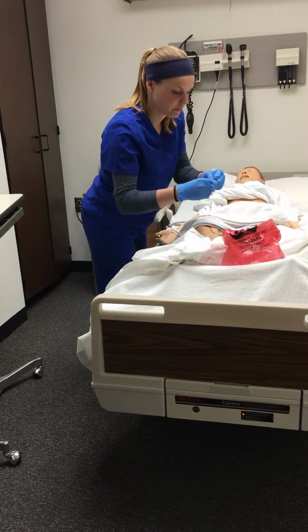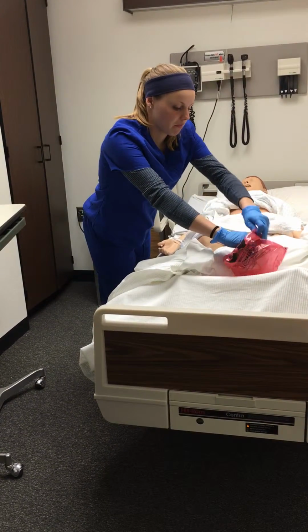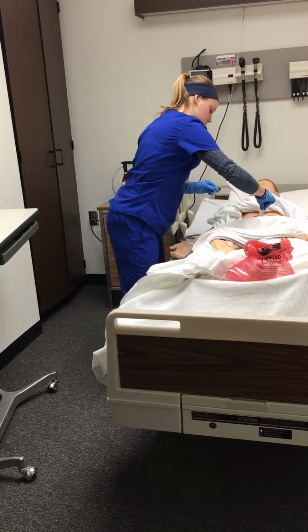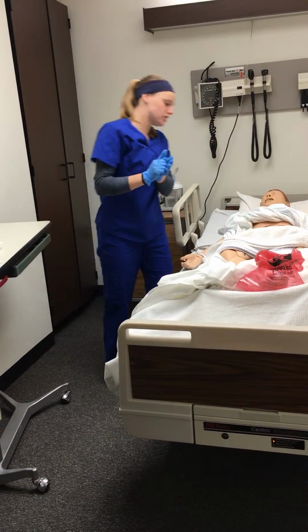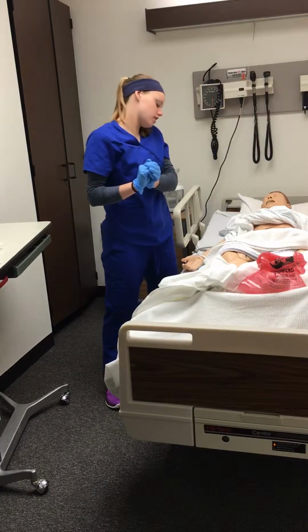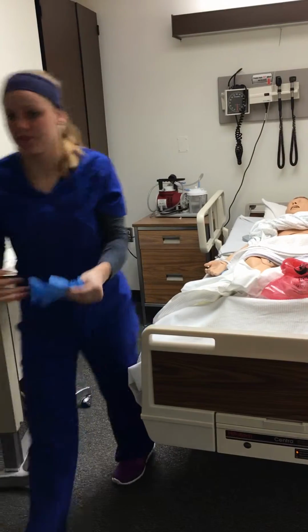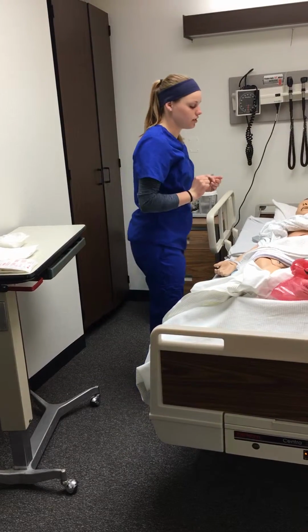Okay. Fold this down. We'll take this off. Then I'm going to assess the wound, and I notice there's no drainage, so we can continue with our wound care. I'm going to take off my clean gloves, dispose of them, and then we're going to do hand hygiene, and then I will put on my sterile gloves to do the cleaning of the wound.